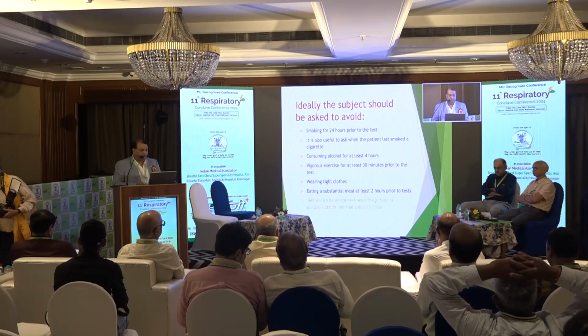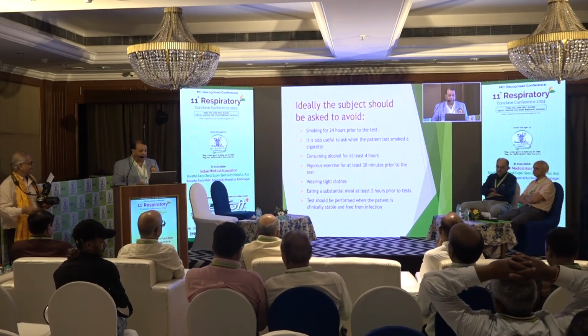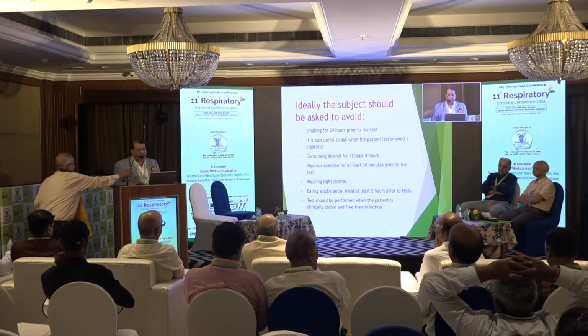and ask the patient when they last smoked a cigarette. Avoid consuming alcohol for at least 4 hours, avoid vigorous exercise for at least 30 minutes, avoid wearing tight clothes, and avoid eating substantial meals for at least 2 hours prior to the test. And this should be performed when the patient is clinically stable and free from any infection.